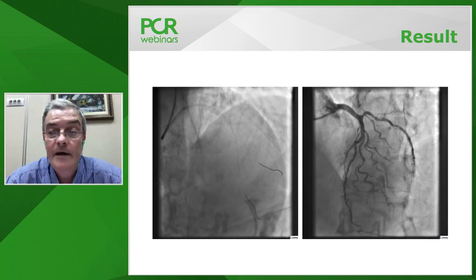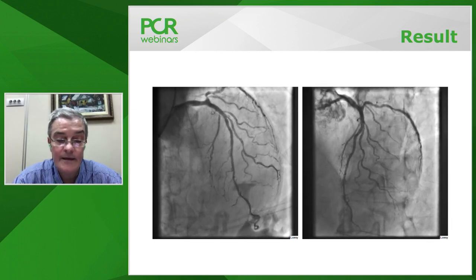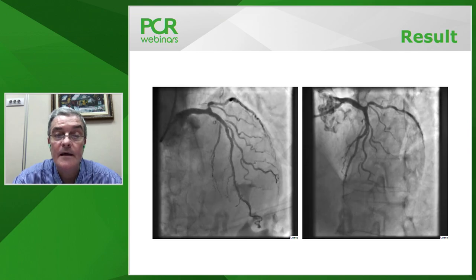Perfect. Dave, while you were describing the case, we received several questions. First, the role of angle in provisional. In this case, it's a very narrow angle and really diffuse disease at the ostium of the diagonal. People ask whether you decided not to predilate because it's not part of your routine practice, or there is some specific reason why in this specific case you did not dilate. Please elaborate on both angle and predilatation.